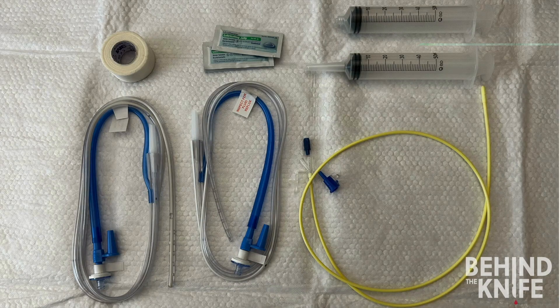Let's go over the supplies we'll need to place an NG tube. A nasogastric tube refers to any tube going from the nose to the stomach, and there are traditionally two types. First, we have the large-bore Salem sump nasogastric tube. These are used to suction out the stomach or administer medications and tube feeds. These tubes are made of a harder plastic and have multiple holes at the end and a separate lumen, usually colored blue, that acts as a sump.